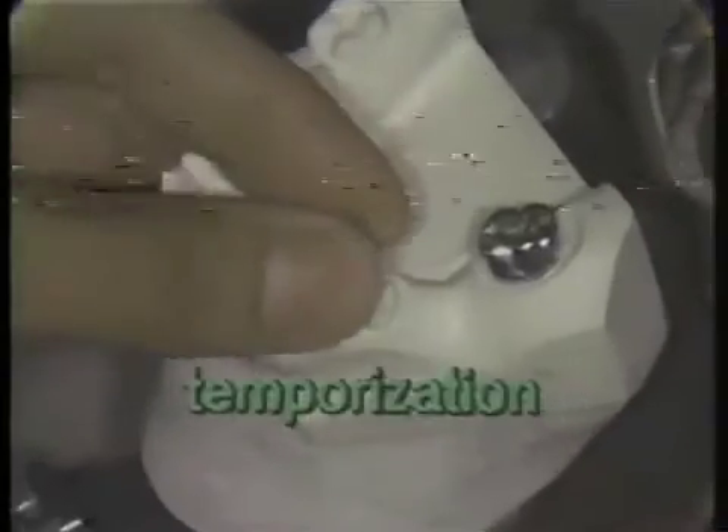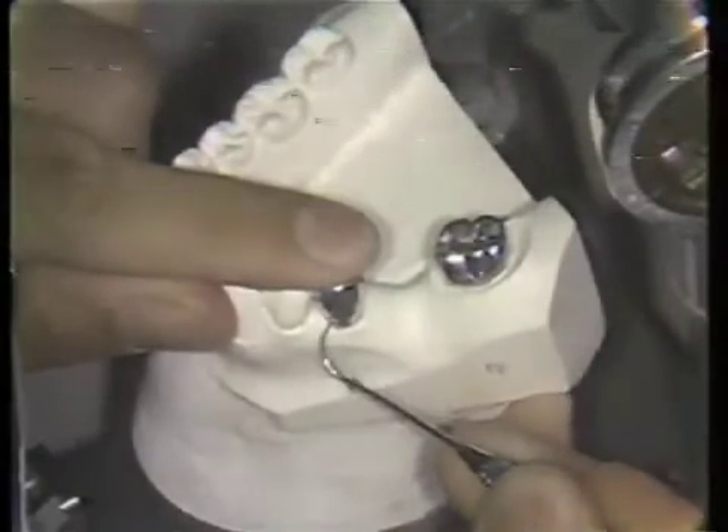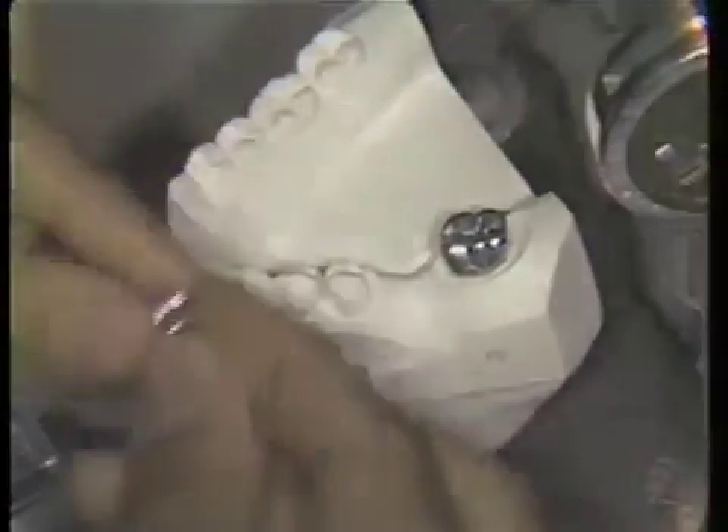The prepared crown is then temporized by placing an ion crown on the bicuspid preparation. The cervical limits of the preparation are traced on the crown with an explorer. The buccal cutout is marked on the buccal surface, and a crown and bridge collar scissors is used to trim the margins to the explorer mark.